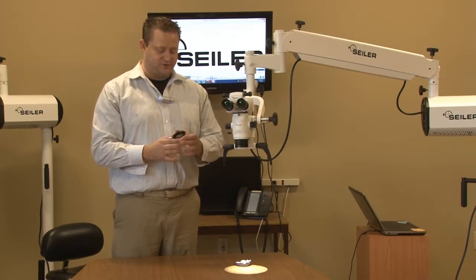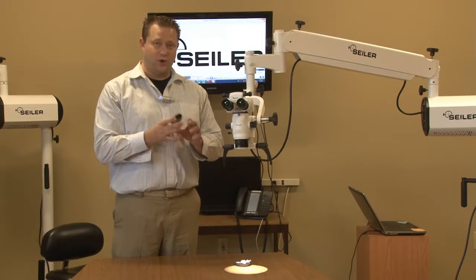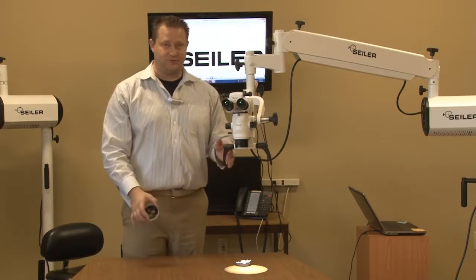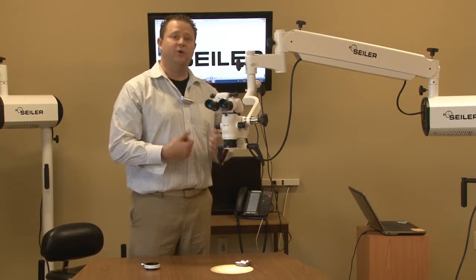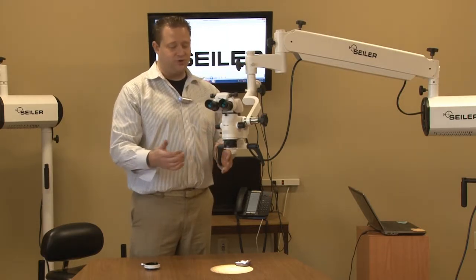What's also very interesting about our laser filter is there's no color distortion whatsoever when you place the laser filter onto the microscope. In today's world, lasers and surgical microscopes go hand-in-hand, and you want to make sure that the end user is protected.